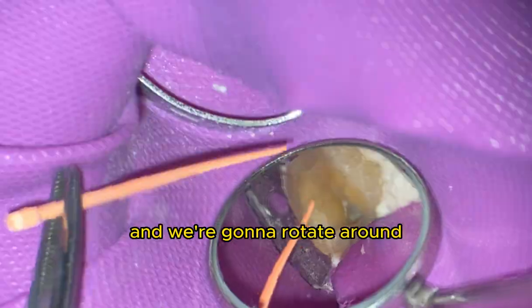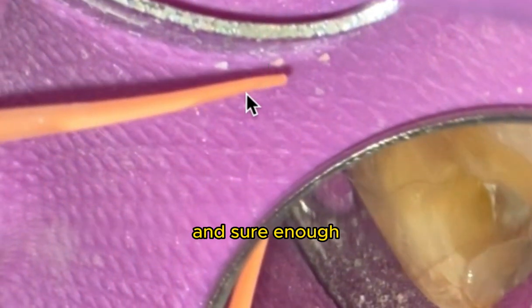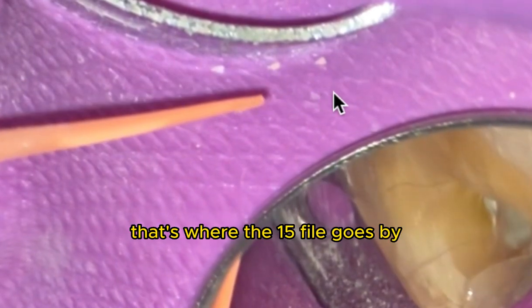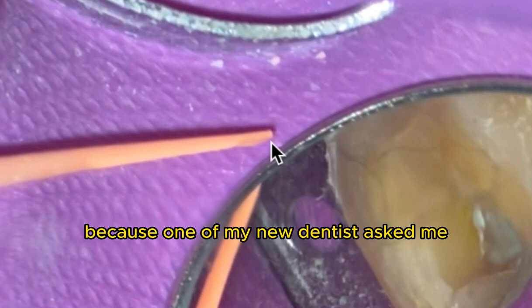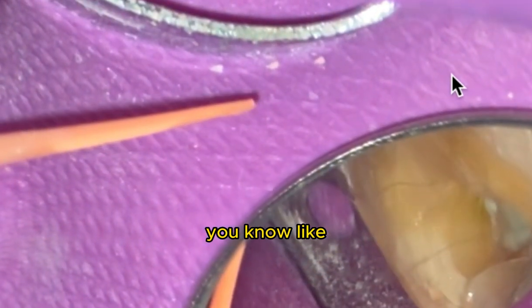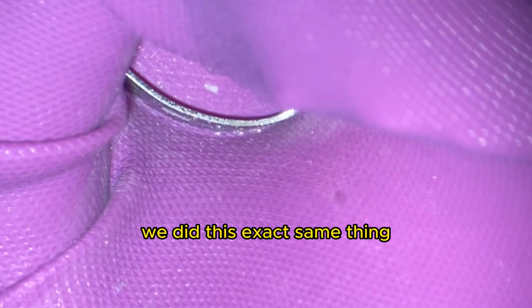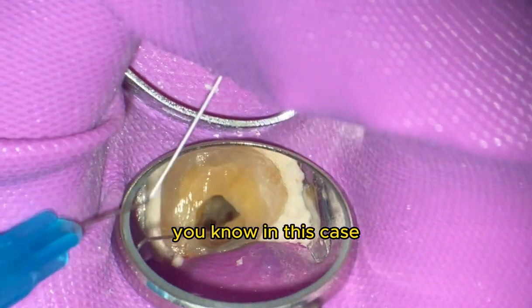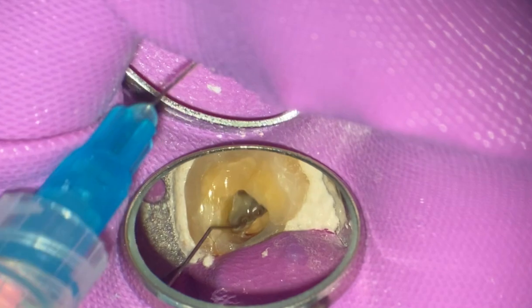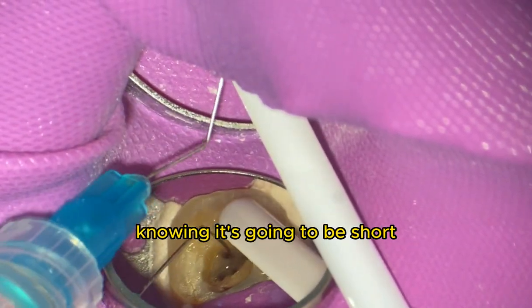You need high magnification and sometimes a specific angle and light — and sure enough, there it is: that's where the 15 file goes by. One of my newer dentists asked for help because one of his canals looked short. We did this exact same thing, and sure enough he wasn't short — he was right on the money. All you need to do is obturate MB1, then place the cone to length at MB2 knowing it's going to appear short because the canals are confluent.